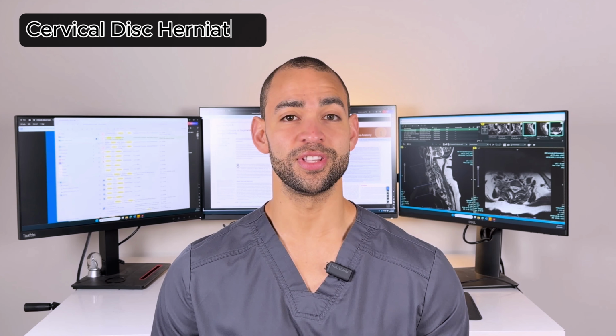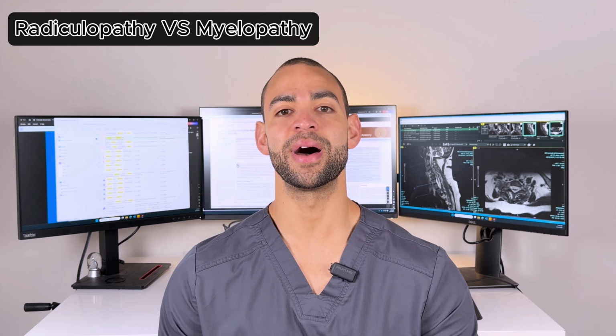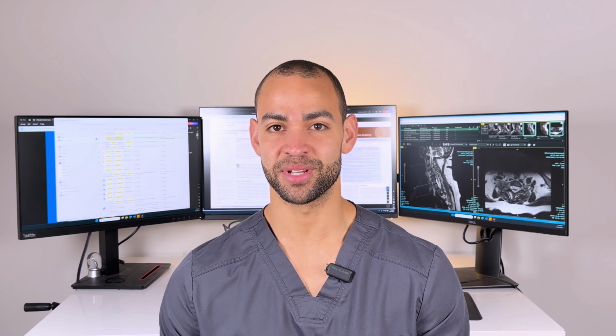By the end, you'll understand the 3 most important things surgeons look for: what cervical disc herniations actually mean, the difference between radiculopathy and myelopathy, and, critically, why not everything on your MRI report is actually causing your symptoms.